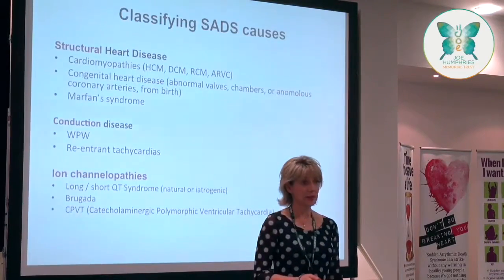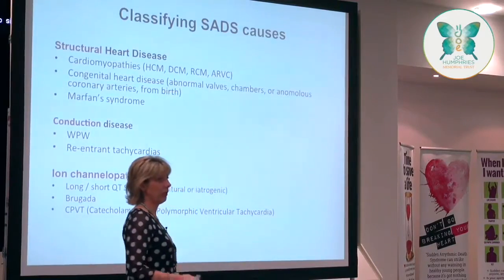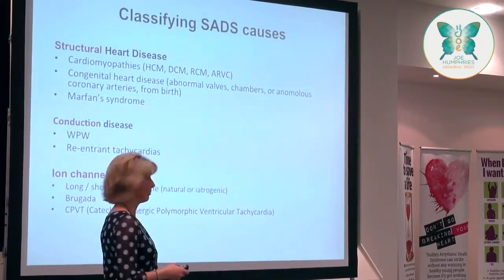So don't worry about this slide being busy, because you're going to see it pop up a lot, because we're going to just work our way down this list of conditions and tell you a little bit about them.